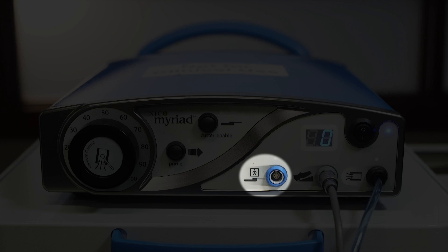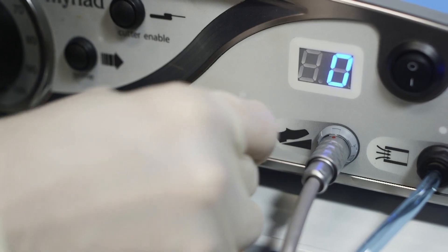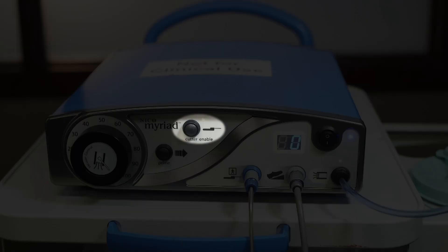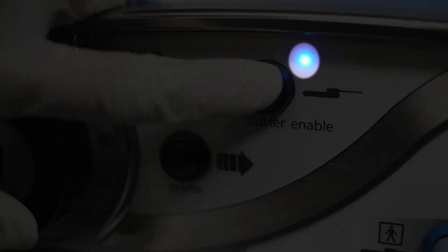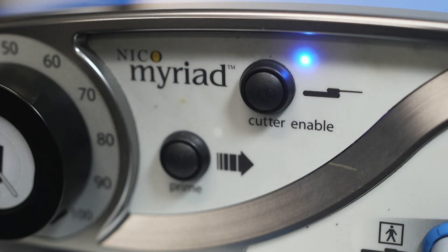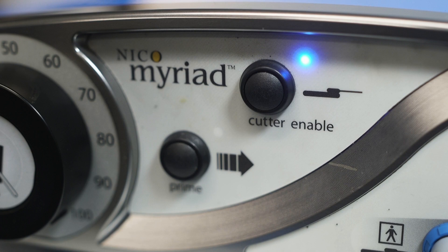This is the attachment site for the handpiece cord to the console. This button enables and disables the cutting mode on the handpiece. The indicator light above this button indicates when cutting is enabled. An audible alert also indicates whether cutting is enabled. Two sequential beeps indicate that cutting is enabled, while a single beep indicates that cutting is disabled.